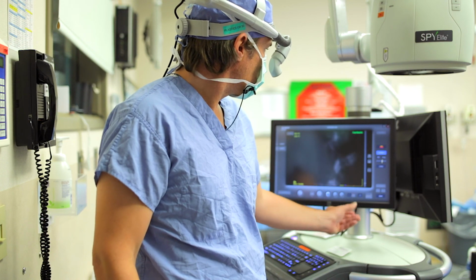So on this image, this is a patient that's had a mastectomy, nipple sparing on the right side, and on the left side, the nipple-areolar complex had to be removed. As you can see, the nipple itself is a little delayed, but you can see the blood vessels going to the nipple-areolar complex are present.